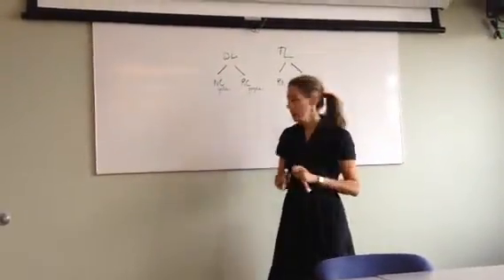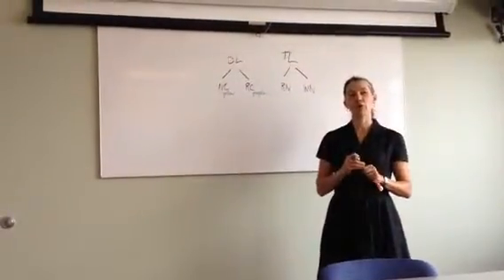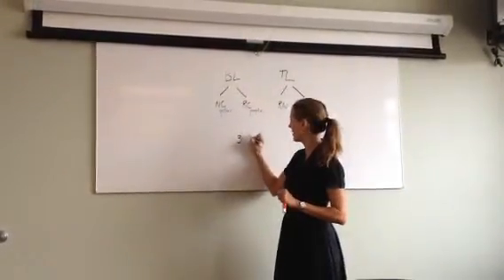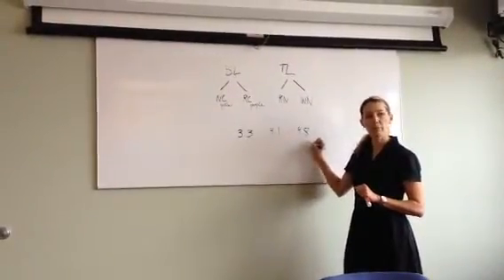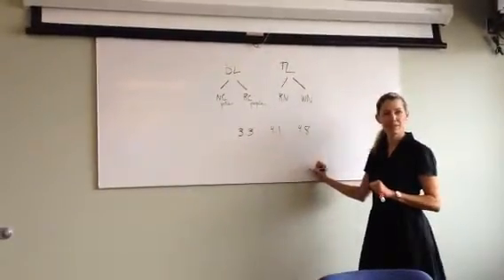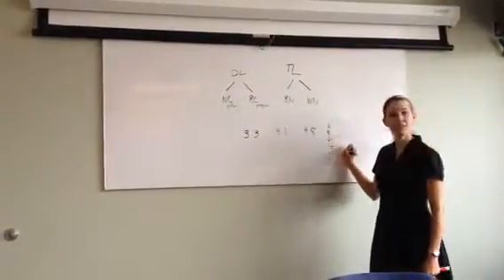Okay. Do you remember the surgical sizes? Surgical diameters of our implants. 3.3, 4.1, 4.8. Yes, that stuck. 3.3, 4.1, and 4.8. Do you remember the lengths? 8, 10, 12. Evens, 8, 10, 12, 14. We actually have a 6. Okay.